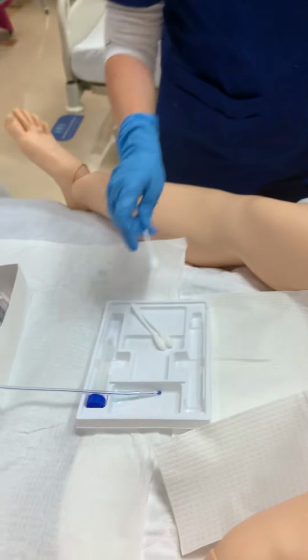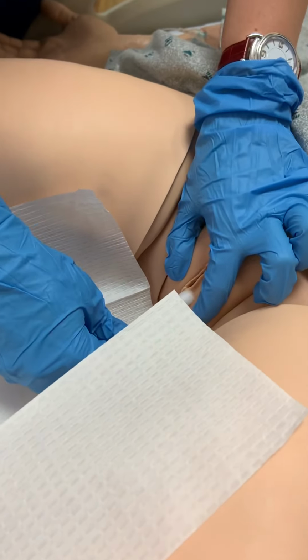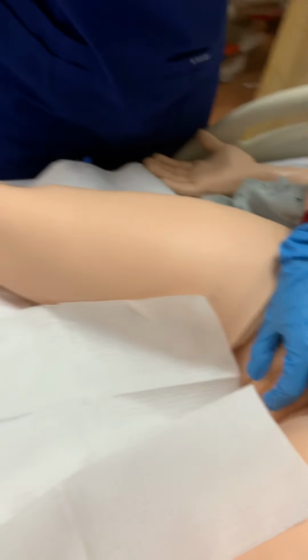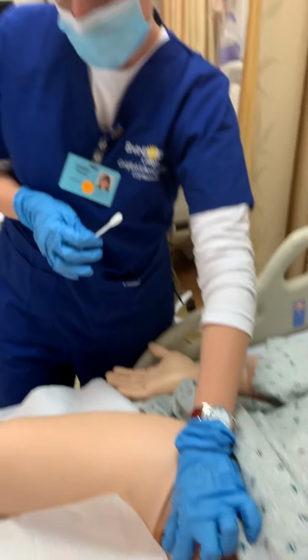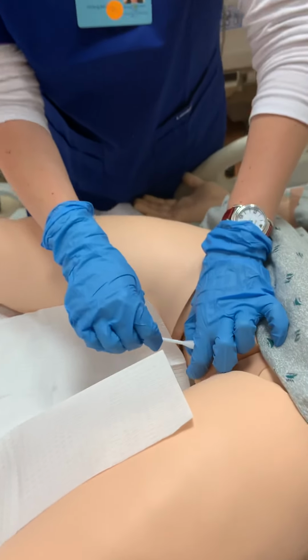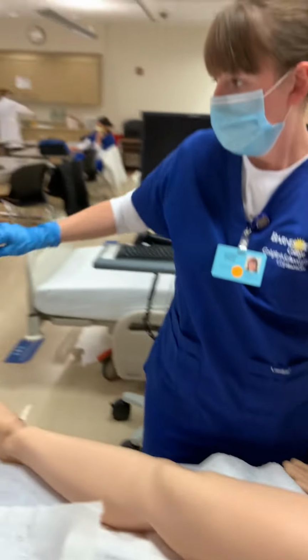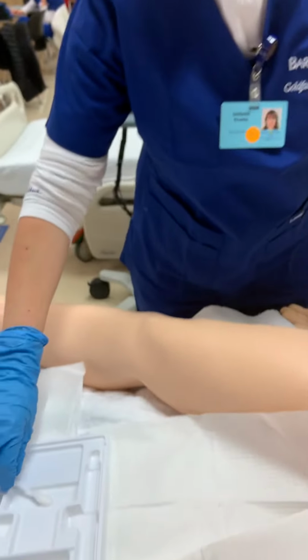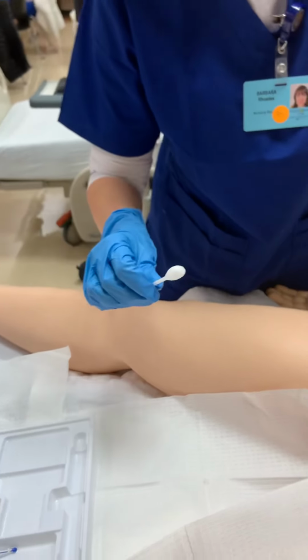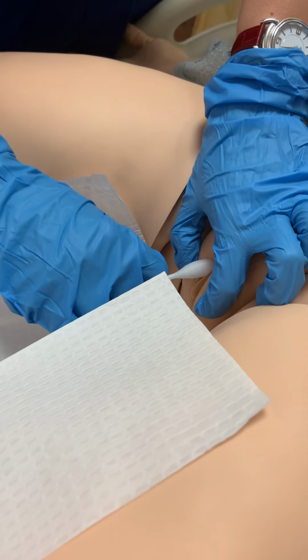Alright, so I'm going to start cleaning this area. And I'm going to start with the outside furthest away from me, from top to bottom. Okay. Pull it out here, put it away. Next I will get the side closest to me, outside from top to bottom. Okay, and with the last one I will be cleaning the inside. Again, from top to bottom.